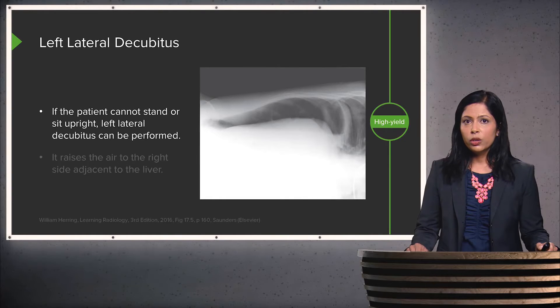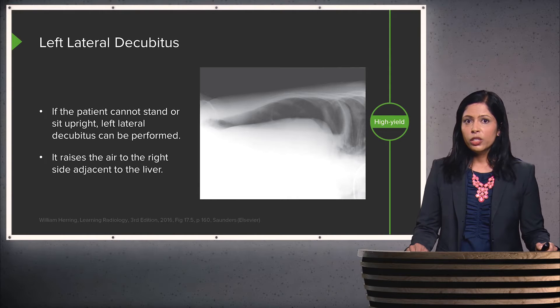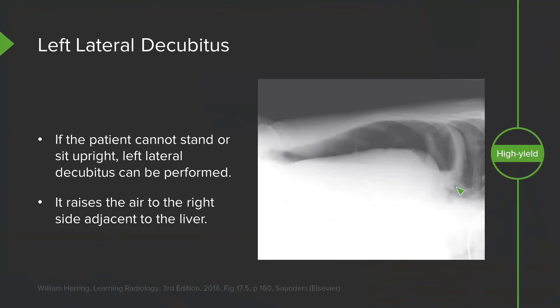You can also perform a left lateral decubitus film for patients who cannot stand up or sit upright. This raises the air to the right side, adjacent to the liver. Here you can see the patient is lying on their left side down — this is the left side, here are the ribs, this is the patient's chest — and you can see free air right adjacent to the soft tissue density of the liver.